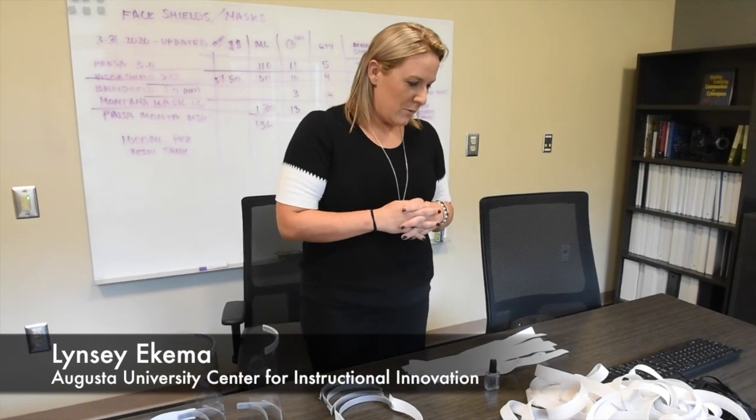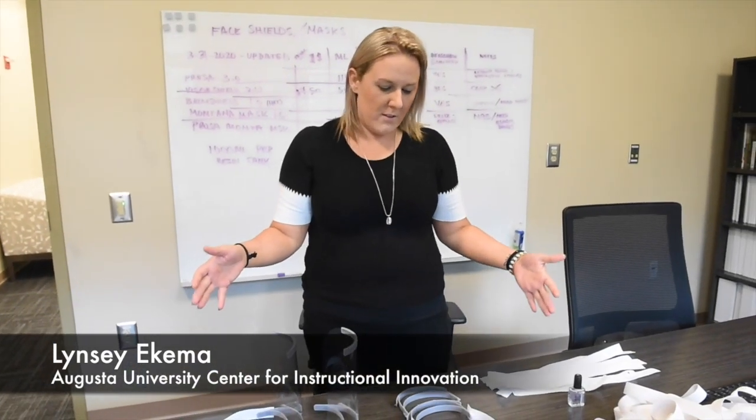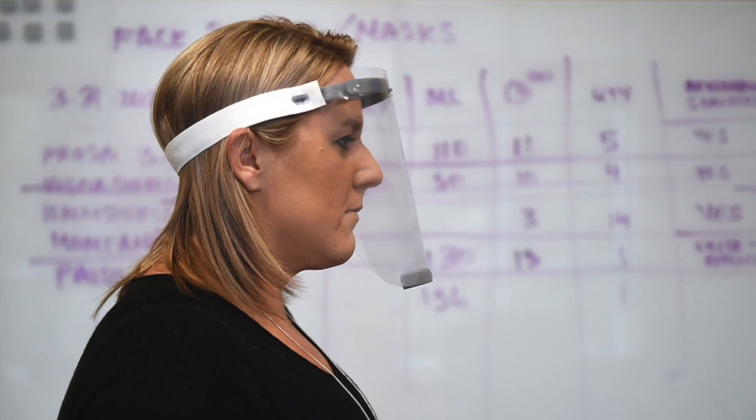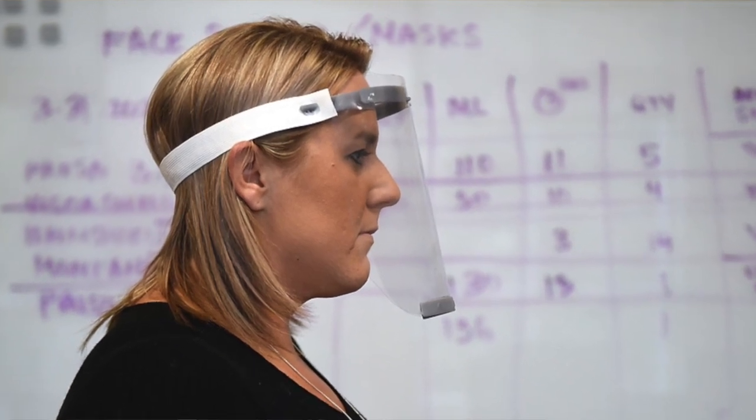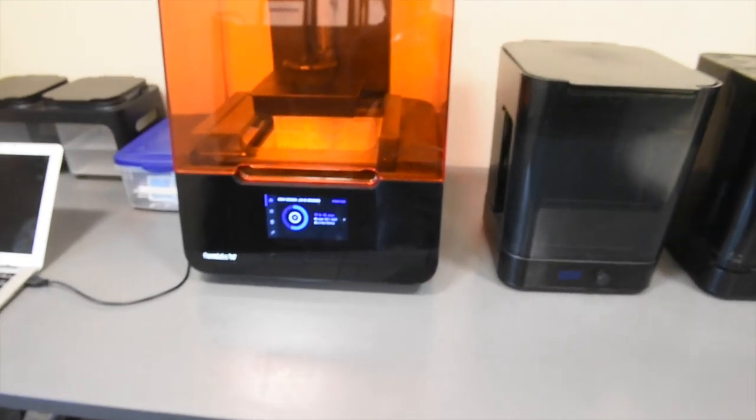I'm Lindsay Ekma, here with the Center for Instructional Innovation. We are here with some of the pieces for our assembly of the 3D printed face shields that we are doing as a task force for the hospital. We've been tasked to make a thousand, and we do have 200 that are being donated by Georgia Southern.